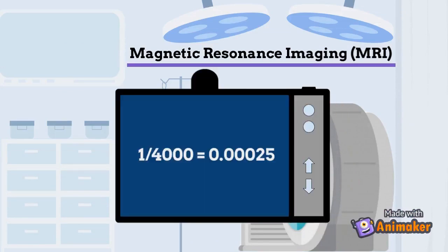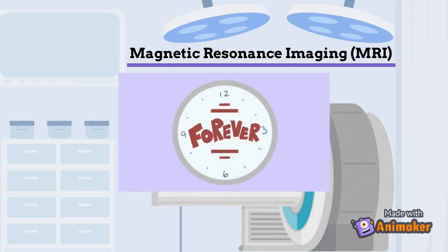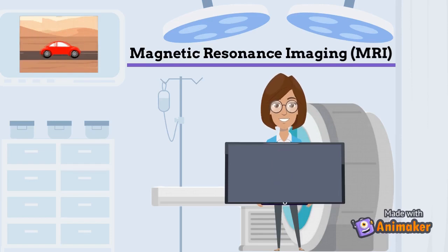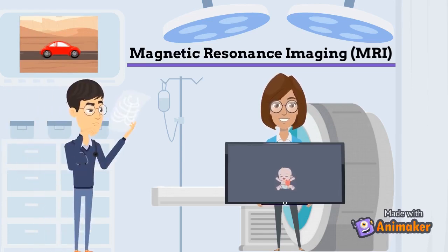While most cameras can take a picture in 1/4000th of a second, an MRI takes many minutes. With your body moving during the acquisition process, you cannot get a clear image. Instead, you get a distorted or blurry image, just like the car we saw earlier. Now imagine taking an MRI of a heart of a fetus while it wiggles around. Blurry images make diagnostics and interpretation very difficult.